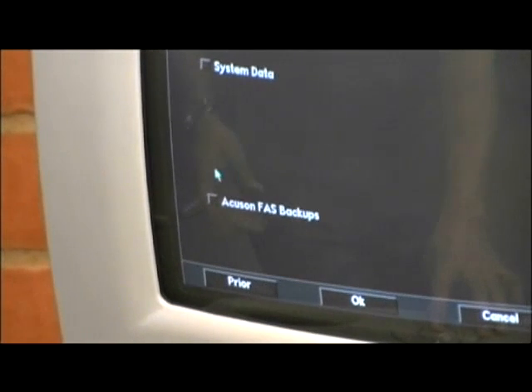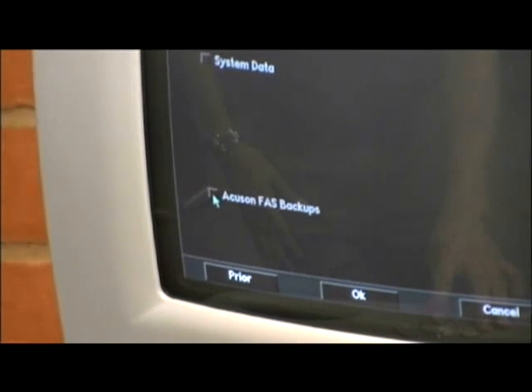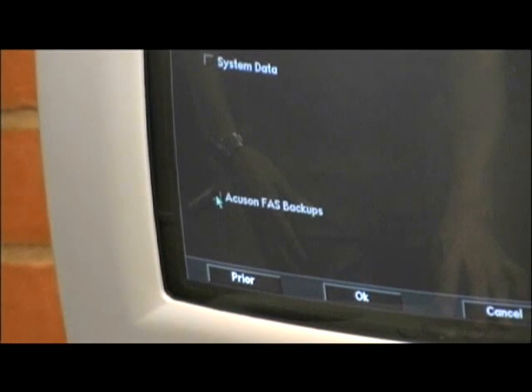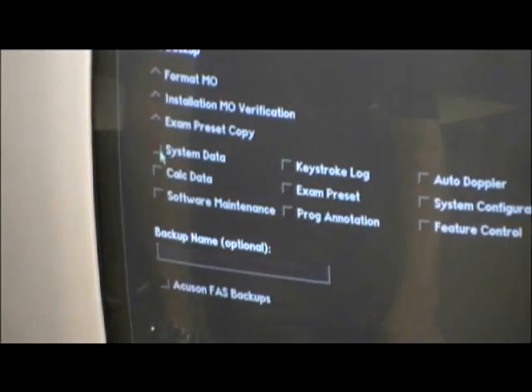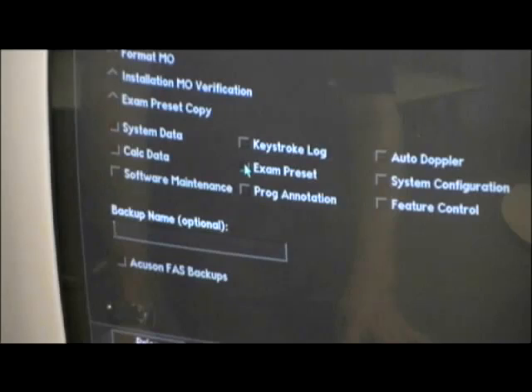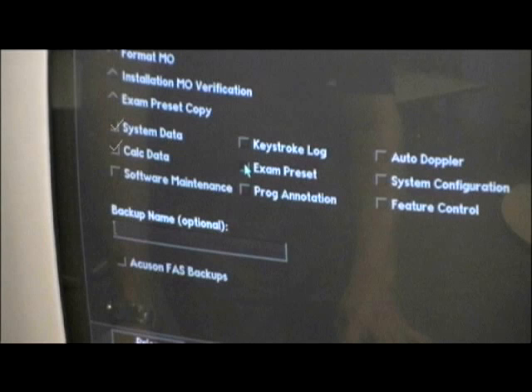Once you are at this screen, scroll to the bottom of the page and check the box for Accuson FAS backups. This will take you to a screen containing files that can be backed up. There are 7 files that we need to back up during this process: System Data, Calc Data, Exam Preset, Program Annotation, Auto Doppler, and System Configuration.